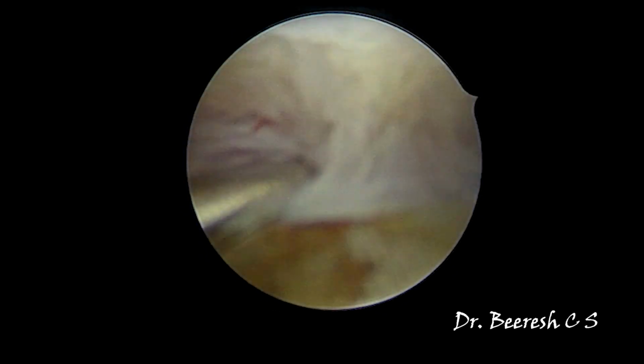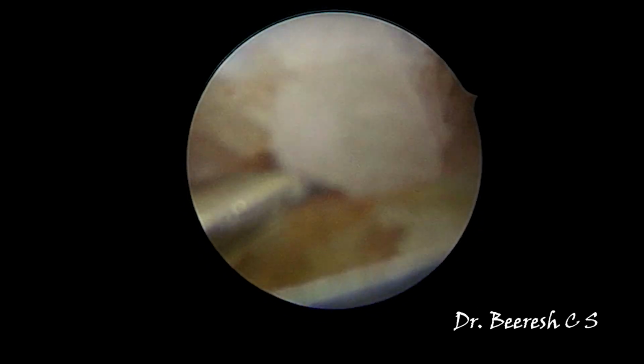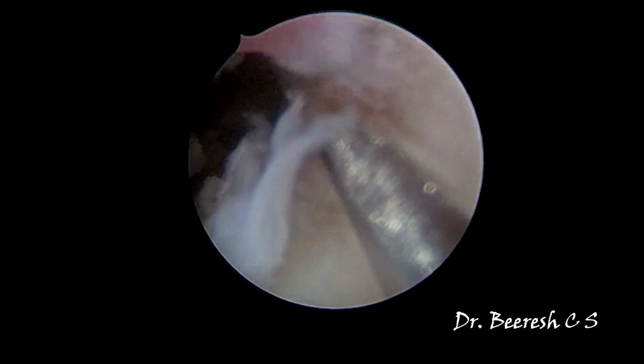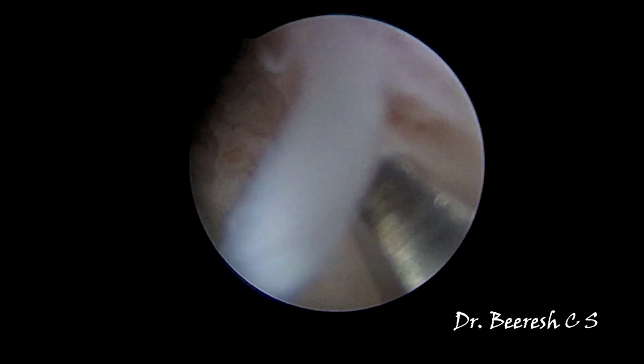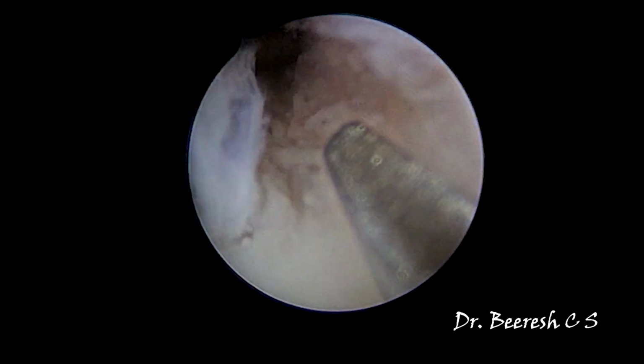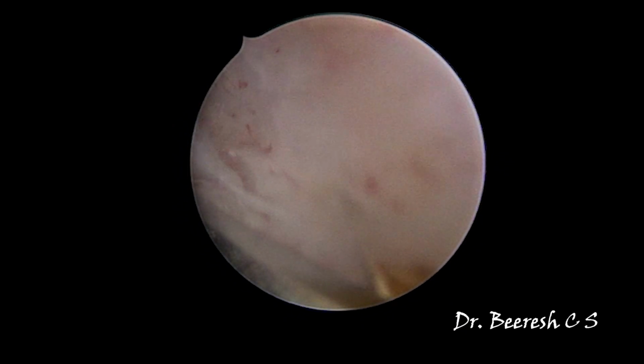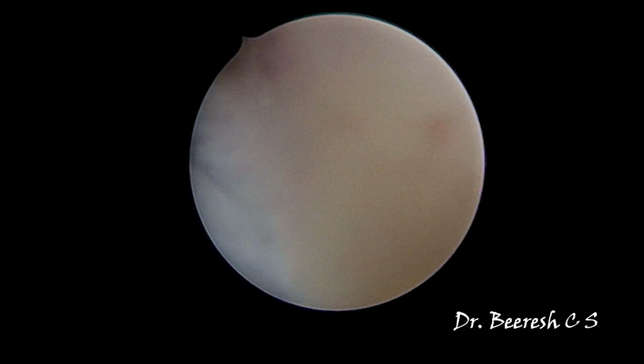Repeatedly I come back and take a panoramic view to see whether I am in line with the ostium. So that's the lateral metroplasty being done on the left side.